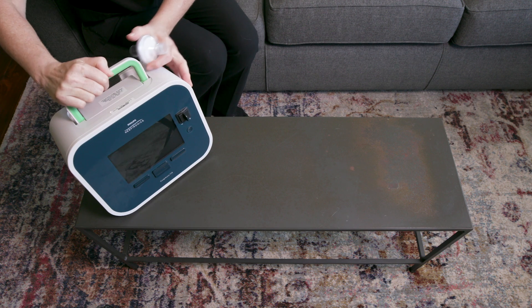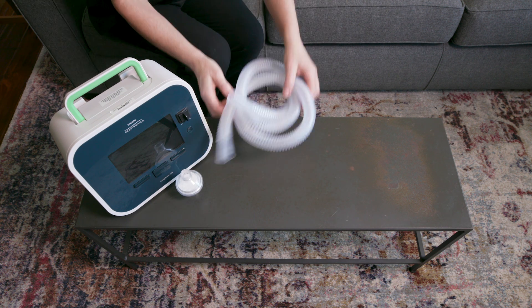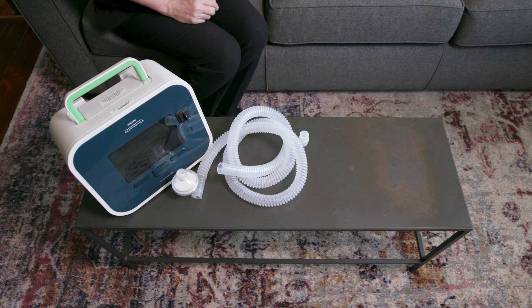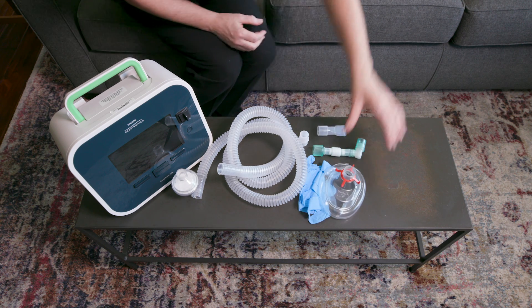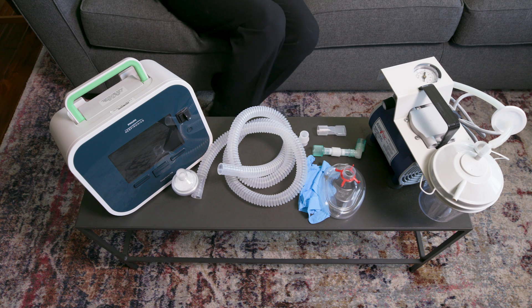Gather the equipment and supplies you need: a cough assist device, a filter, a piece of corrugated tubing, an adapter, non-sterile gloves, a patient interface such as a mouthpiece, face mask, or trach tube adapter, and a suction machine and supplies if the patient uses one.